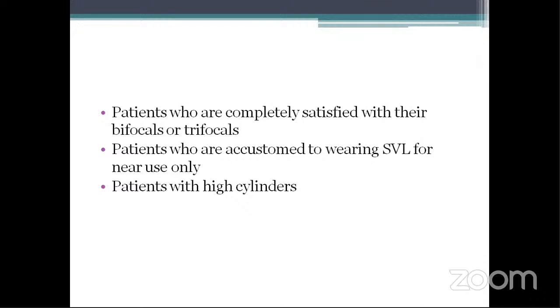Patients who are accustomed to wearing single vision lens for near vision only. So patients who are regularly using single vision reading glasses for near use, such patients may not accept to shift to progressive all of a sudden. Next, patients with high cylinders.